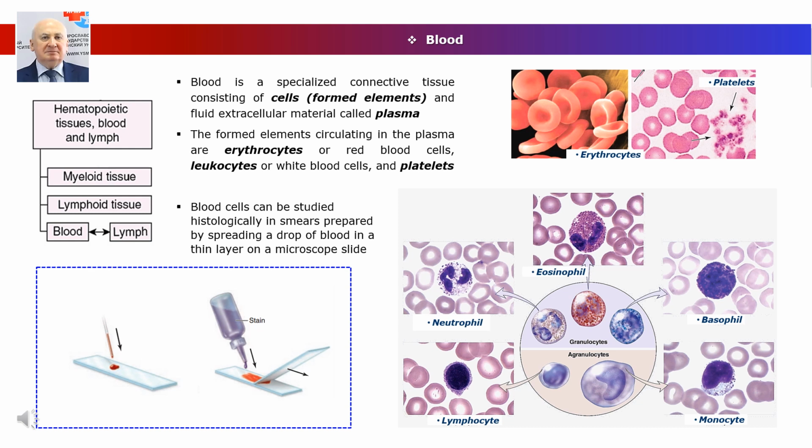Leukocytes are divided into two major groups, granulocytes and agranulocytes, based on the density of their cytoplasmic granules. Their estimated sizes mentioned here refer to observations in blood smears in which the cells are spread and appear slightly larger than they are in the circulation.